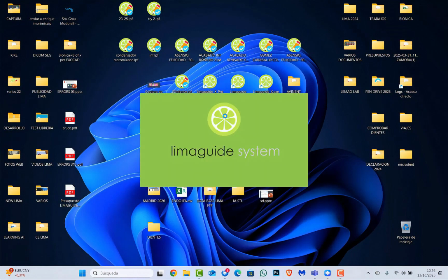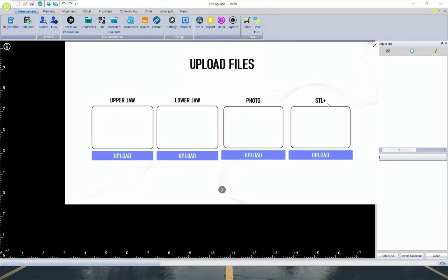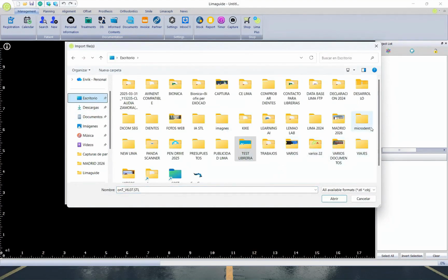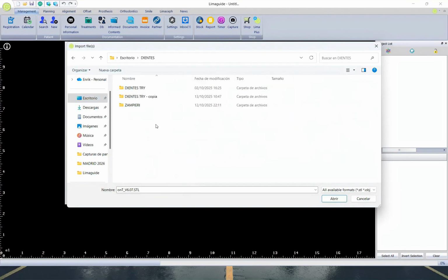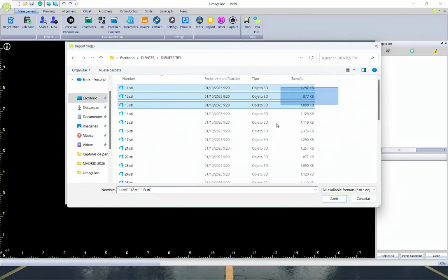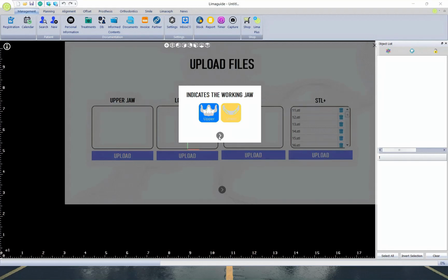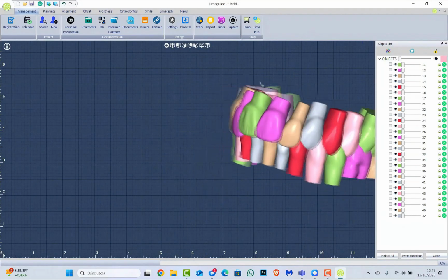Okay, then, so we are going to open Limaguide and start creating our own library. The first thing is to import. So I'm going to click on Open STL. I go to the STL Plus box and I'm going to upload all the STLs from my folder. I just select all of them, and now I just go ahead, then choose the jaw, and then we just upload them. And as you can see, they are all more or less aligned.